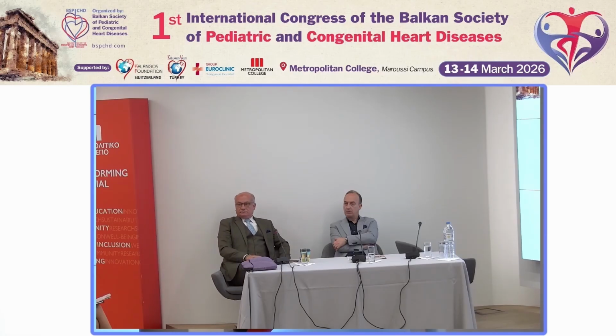So the gold standard for imaging valves is echocardiography, full stop. Now we have the opportunity to, and we should actually, use more 3D echo. And 3D echo allows us to fuse all the imaging together with the CT. MRI, I would still prefer to use as additional information for the hemodynamic data. But definitely, particularly in children, the gold standard is echocardiography. It's by far the best imaging because of the temporal resolution and the spatial resolution.